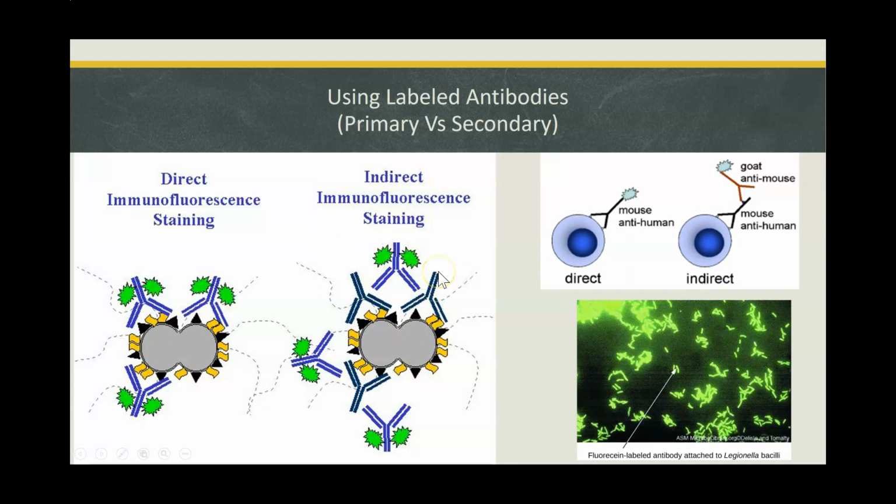This secondary antibody is commercially available. They will bind human antibodies and are linked to a fluorophore. Secondary antibodies are made by immunizing an animal, such as a goat, with purified human antibodies, and the goat will respond with its own antibodies to the foreign protein. The goat anti-human antibodies are isolated from the goat serum and linked to a fluorophore and marketed. Secondary antibodies are useful for detecting patient antibodies and have other uses as well. Once a secondary antibody binds, the cell fluoresces green, so now you know the patient had antibodies that bound.